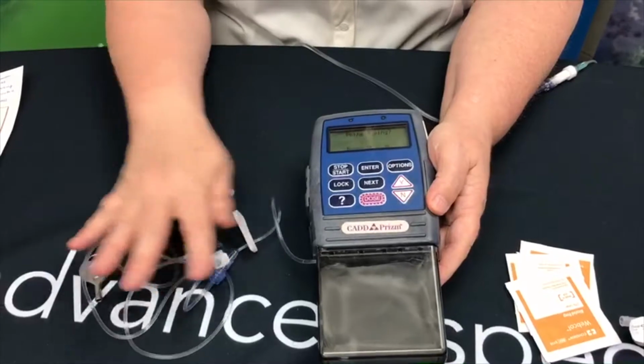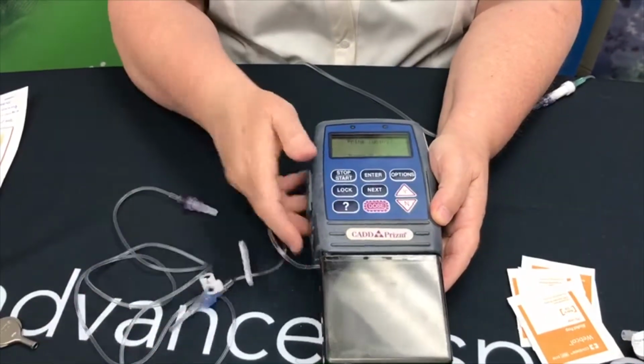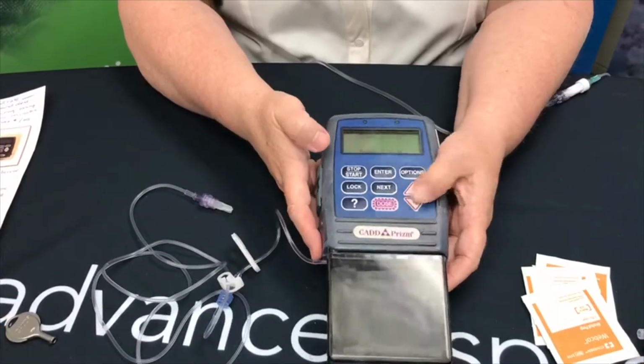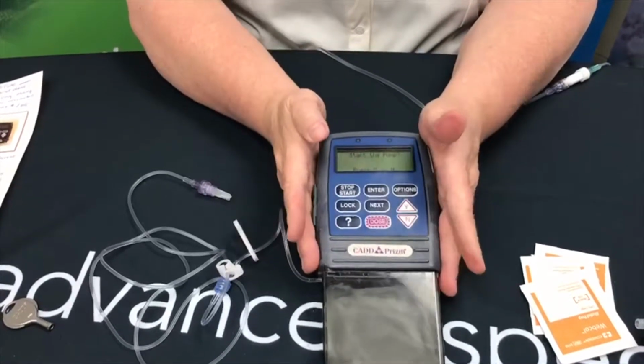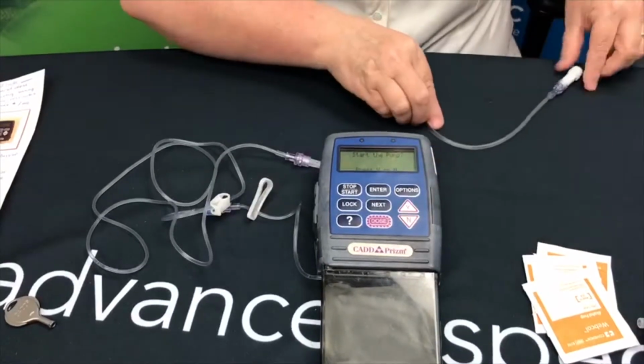This tubing has already been pre-primed by my pharmacist, so you do not need to prime it. So anytime it asks you if you want to prime the tubing, you're going to say no. Now it asks me if I want to start the pump. I can't start my pump until I've attached my tubing to my IV line.